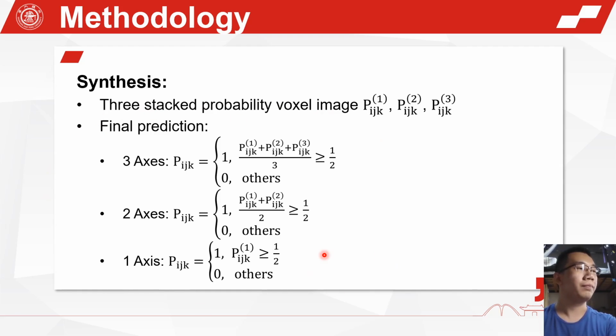Besides, we will get 7 different results in total, 1 for the 3-axis version, 3 for the 2-axis version, and another 3 for the 1-axis version. Users can choose the best one and resize it back to its true size and position.